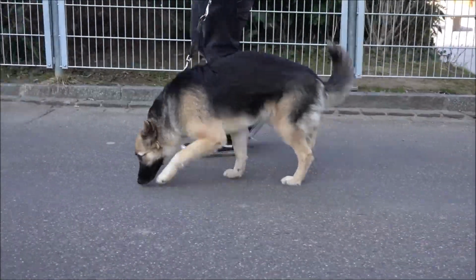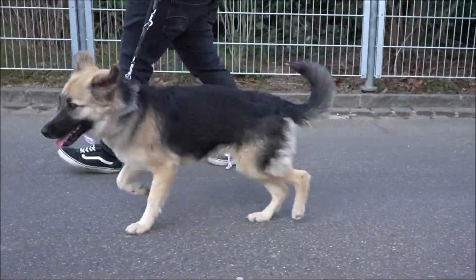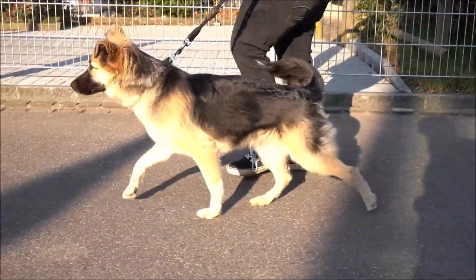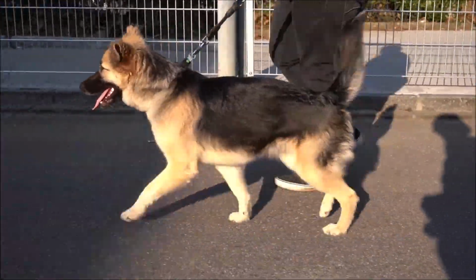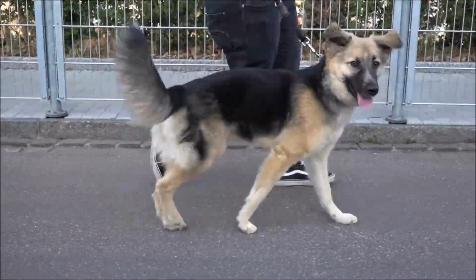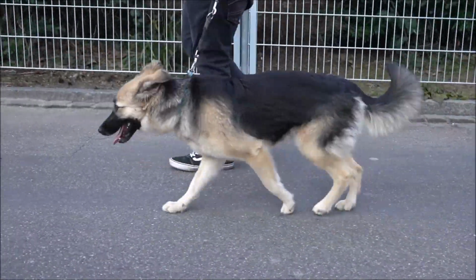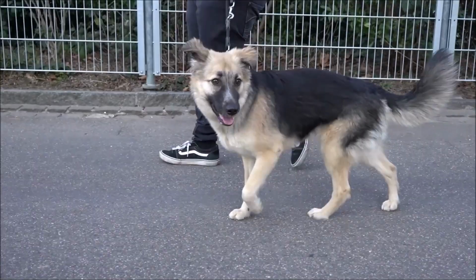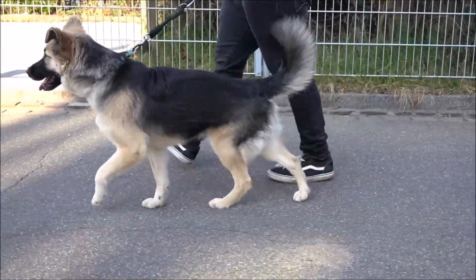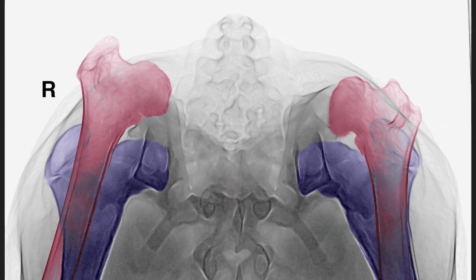Examination of the left pelvic limb, hip, and knee is unremarkable and not painful. However, the right side is quite reactive. On the one hand, the Ortolani test is positive because the femur is not in the hip but is freely movable. On the other hand, the unequal length of both hind legs is noticeable. The left, operated limb is longer because the connection between the limb and the hip is stable here. Since the right pelvic limb is displaced upwards and does not articulate in the joint, this side is shortened and painful. On both projections, it is clearly visible that the right limb is not in the socket.